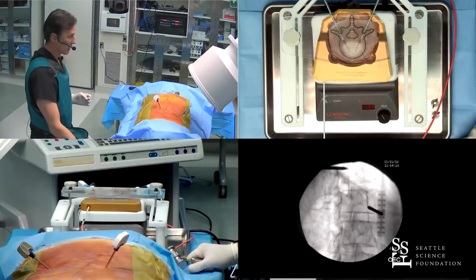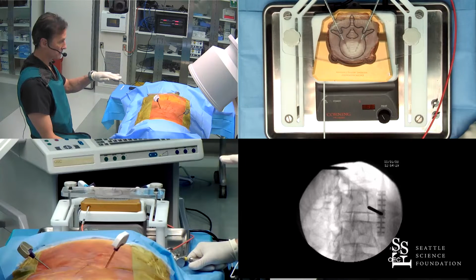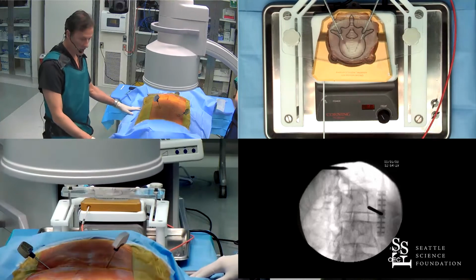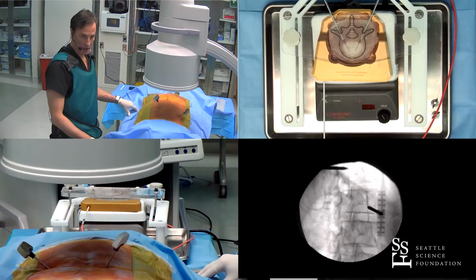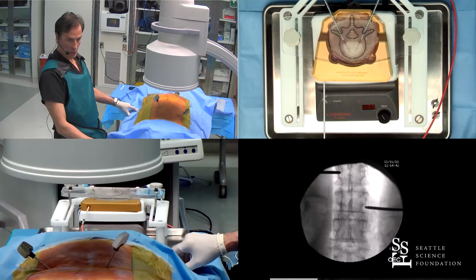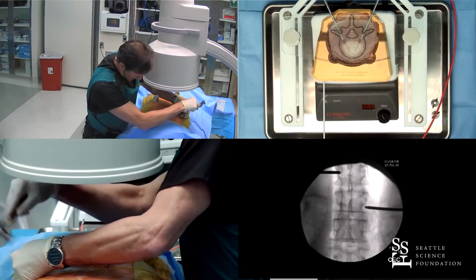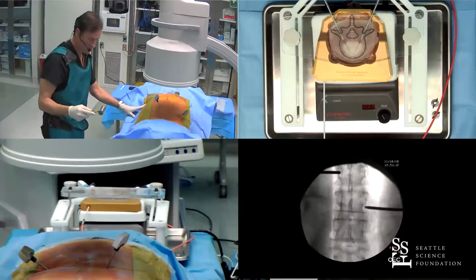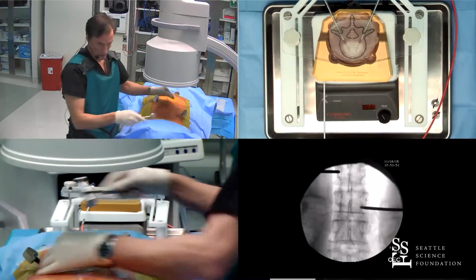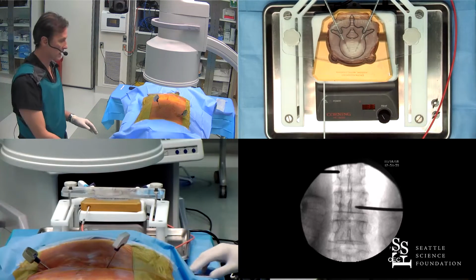I feel osseous already, so I'd like to come back directly AP, and we'll take a look at it. If this looks odd to you, this is a pretty typical approach. This is a fairly typical, easy way to access the center of the vertebral body. So let's drive it on in. And we'll park it right about close to midline there, and we'll take a lateral view.